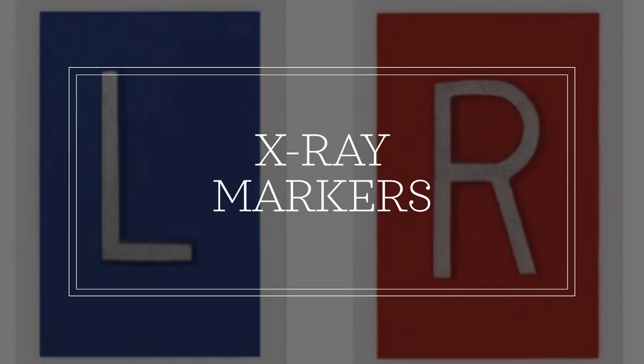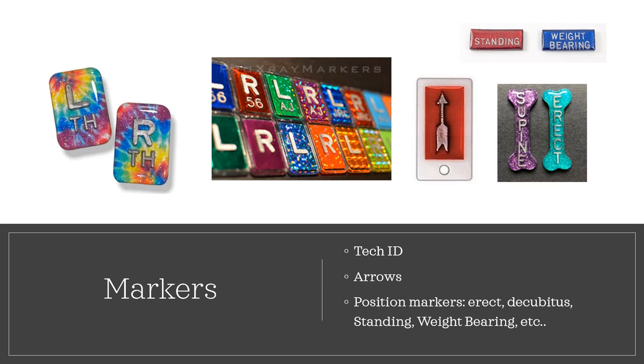X-ray markers. Lead markers are used to identify the correct right and left sides. Variations in standard procedure, timed procedures: they are constructed of lead, so they are radiopaque material that blocks the passage of X-ray. It is required for each view. Markers, as you can see, come in many different kinds and types. You have tech IDs, positioning markers, arrows, erect, decubitus, standing, weight bearing, time, and so on. Radiopaque means can't penetrate, and they will be magnified on the tabletop or on the patient.